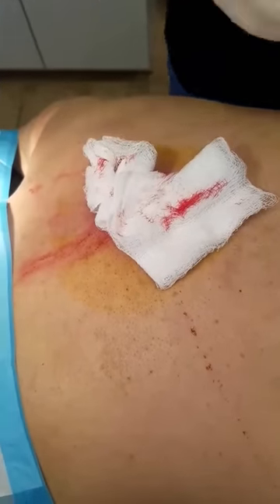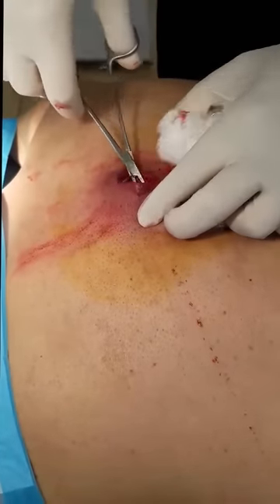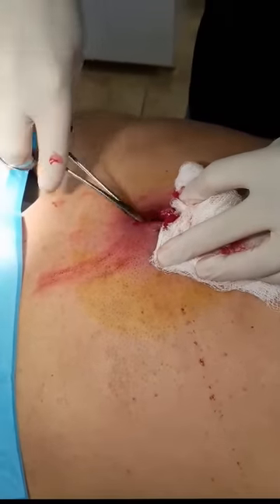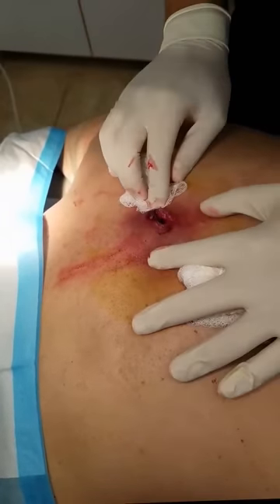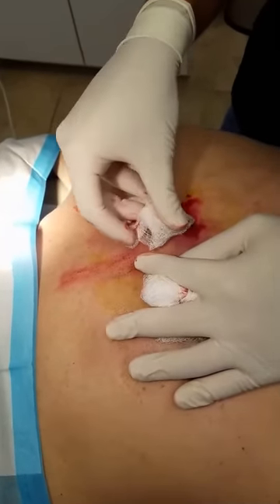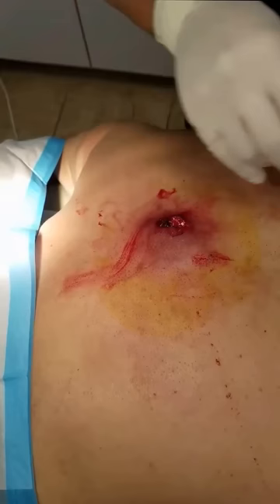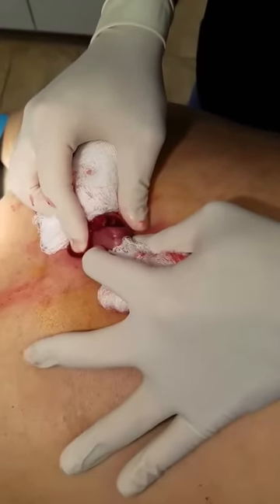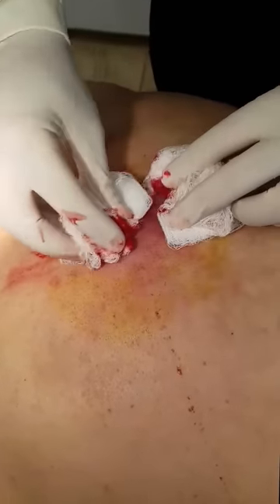Get some forceps and try to get the capsule out — go in there. This looks almost like an infected cyst more than anything, but it had quite a bit of pus in there and infected fat cells. We got a lot of this infected tissue out of it. Put a little bit of gauze dressing in there so that way the wound closes up and we'll get you some antibiotics and go from there.